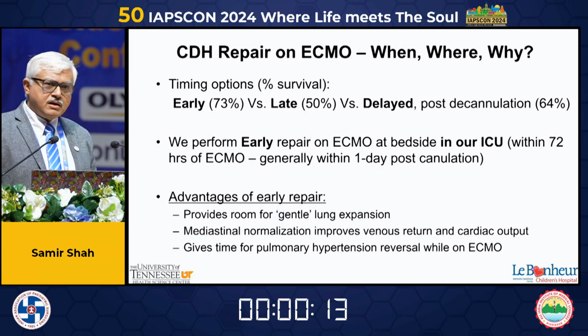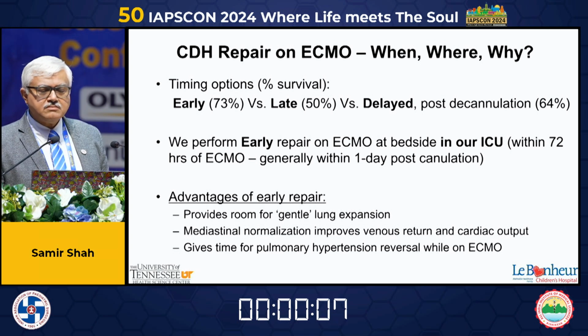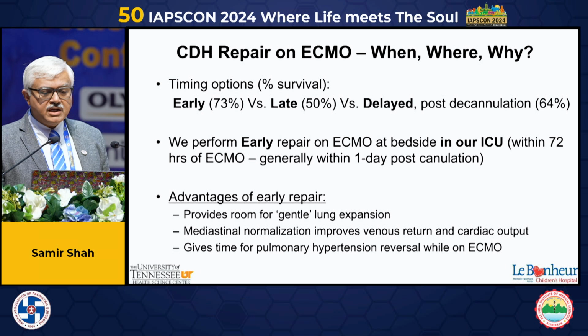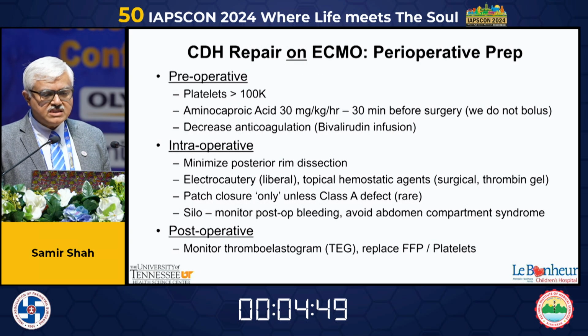When do we repair our CDH patients? The literature supports early repair, 73% survival, versus late repair, which has a 50% survival. At our institution, we perform early repair on ECMO at bedside in our ICU within the first 72 hours, and generally within 1 day post-cannulation. And the advantages are quite clear in our mind. It gives you room for gentle lung expansion, mediastinal normalization, and also gives you time for recovery from the pulmonary hypertension.